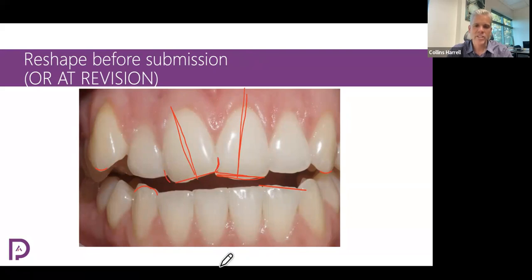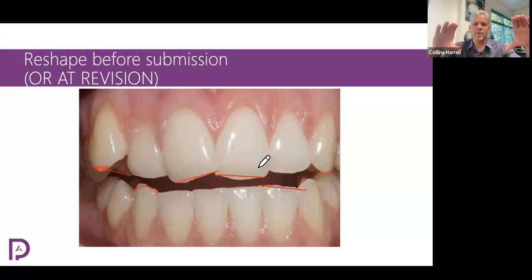the mesial incisal or distal incisal corner line angle. She's not real bad, but just create nice, even incisal edges. Look at the cusp. If you have one cuspid that's worn flat and one that's real sharp that's never been worn, you might want to get rid of the sharp part on the unworn cusp, so that as the technician is setting this up, all the teeth are symmetrical, right versus left.